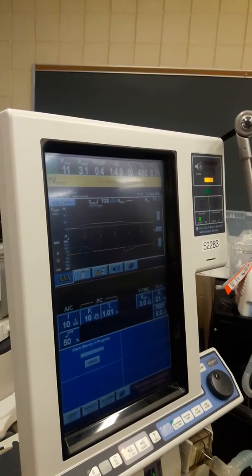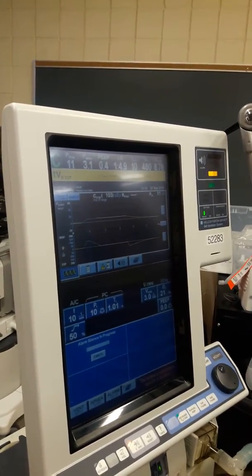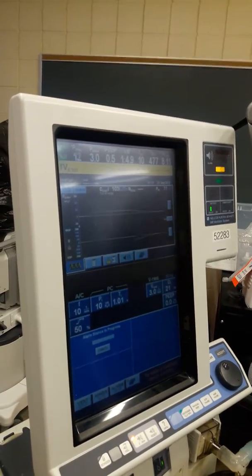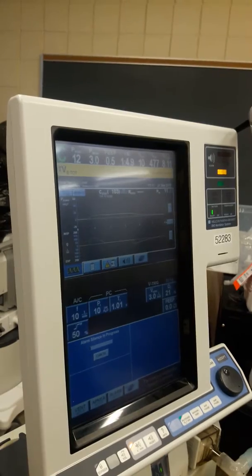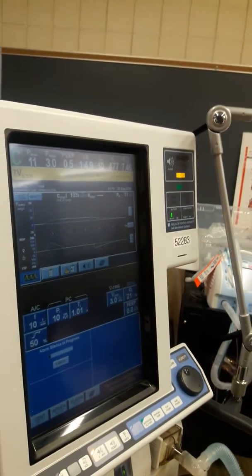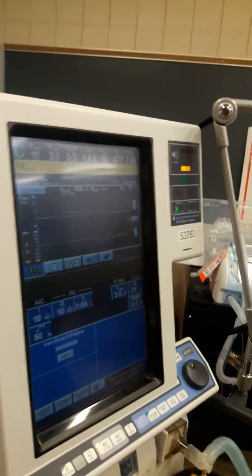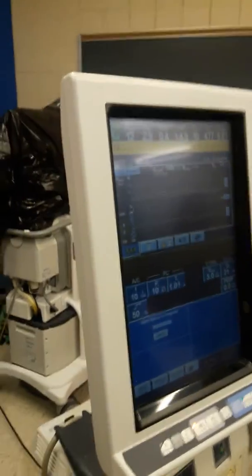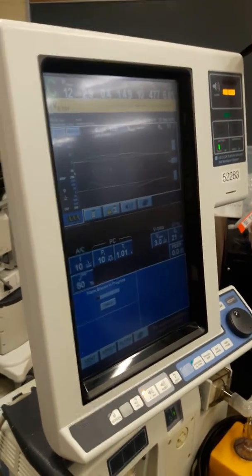Give it a second to go down. So what is my volume now? 480. So you increased compliance? I just decreased it. But you'll see. So now things are changing in my lung. Perform a plateau pressure.